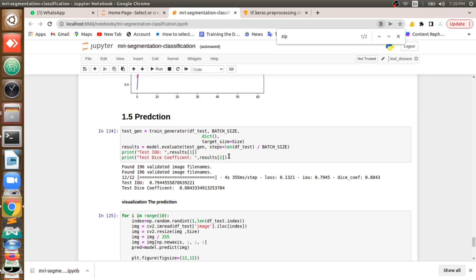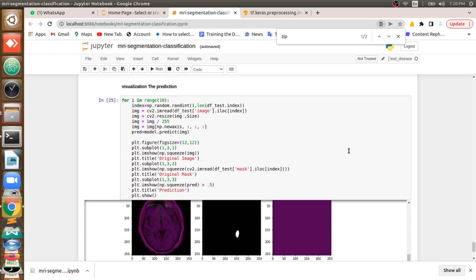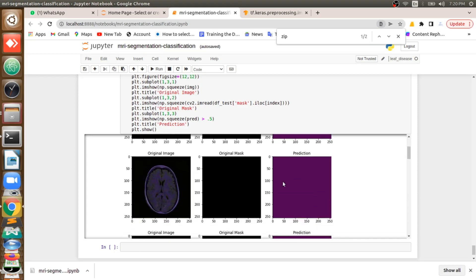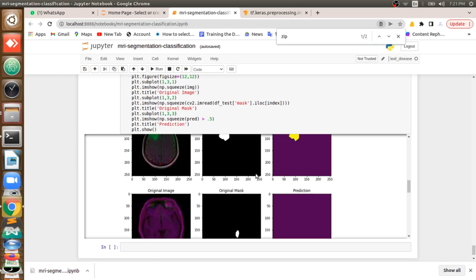When we do validation on the validation dataset, we get 79 percent accuracy — meaning for 100 images the model correctly predicts the mask for 79. To verify this, I feed some random images from the test data and plot the results. You can see the original input image, the original mask, and what my model predicts — it is very close. There is a color difference due to BGR vs. RGB, but converting to RGB would make them the same. Here you can also see that where there is no tumor, there is no mask predicted, which is correct.